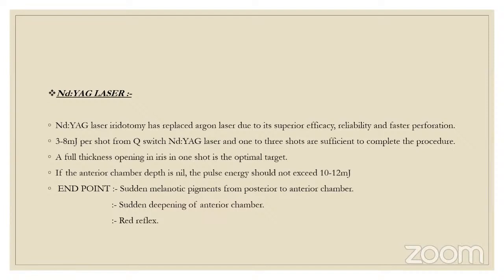Do we use offset in this case? What is the offset? You have seen the zero offset on the YAG laser, no? Yes, sir. So what are the offsets which are available? 125, 150. We have anterior as well as posterior offsets available. Wherever the aiming beam is, the actual laser will be fired posteriorly if we are using posterior offset.